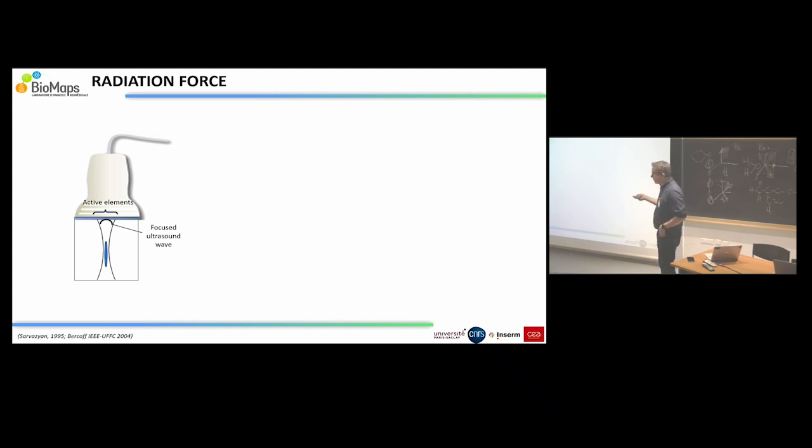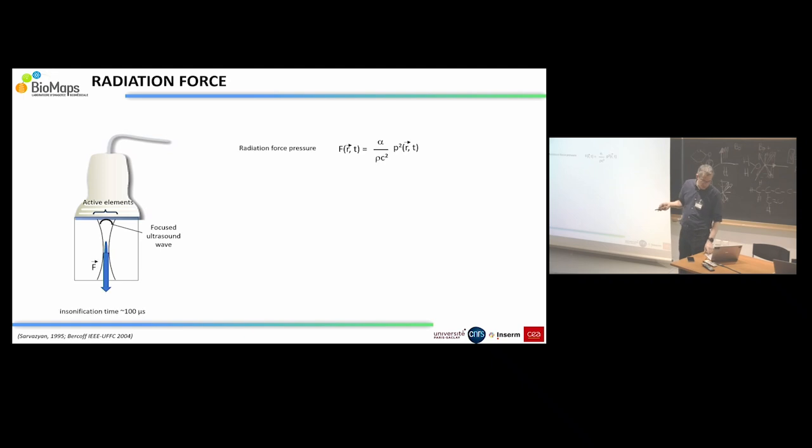Now, if you increase the focusing time to about 100, 200 microseconds at the focal spot, you will generate a force, which depends on the absorption of tissue and the energy you send. And this force will push tissue. It's exactly like an ultrasound wind, something like that.